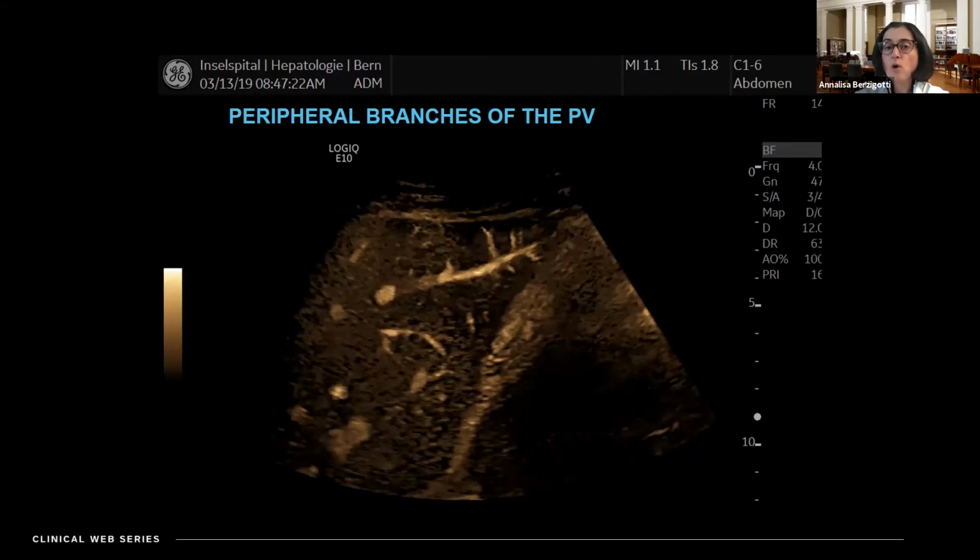And for those of you who are interested in the rare vascular liver diseases or intrahepatic causes of portal hypertension, you might remember that the so-called portosinusoidal vascular disease or idiopathic portal hypertension is characterized by abnormal morphology of the peripheral branches of the portal vein, which I think you might be able to study in a very simple way with this technology.